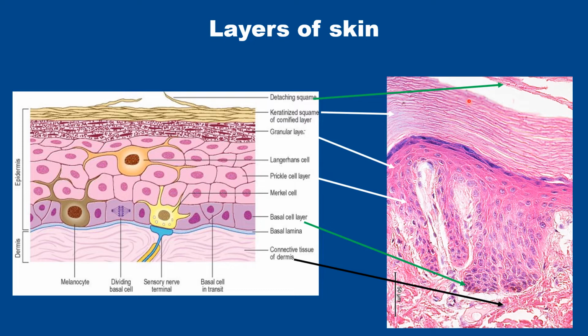You can see the multiple layers of dead cells, where you can see only the margins of the cells. In between there are white substances. There is no nucleus. Here also in the drawing the nuclei have not been drawn. So in these cells nuclei are not there, and in case of the thick skin this layer may be up to 50 cell thickness. In case of the thin skin it may be up to 10 to 15 cell thickness.